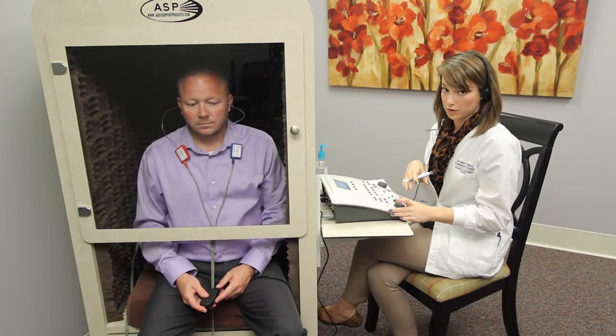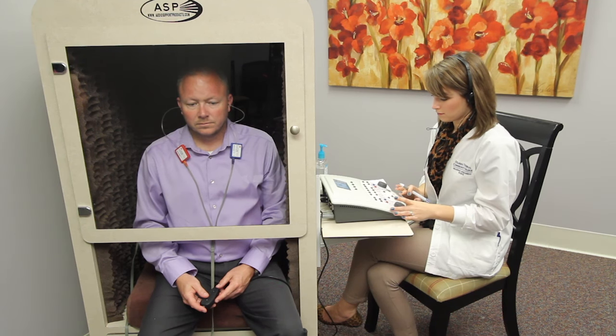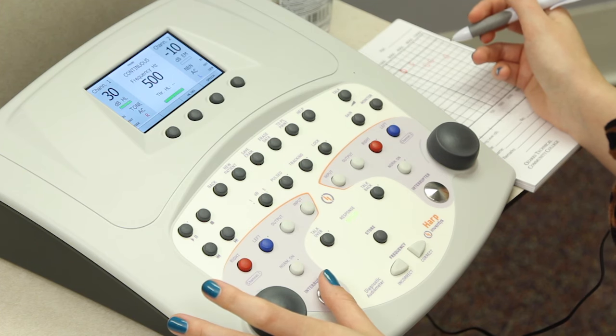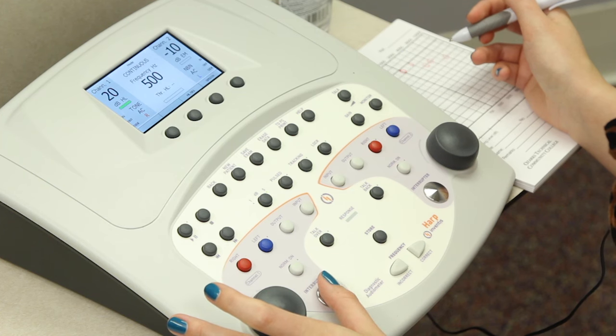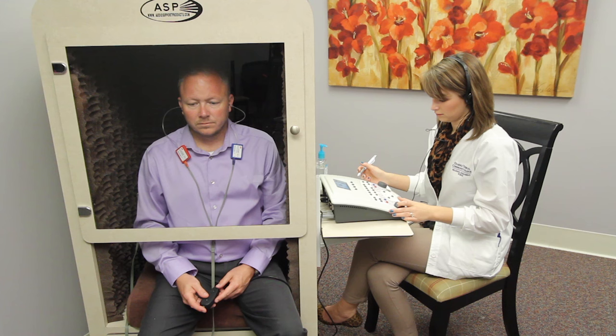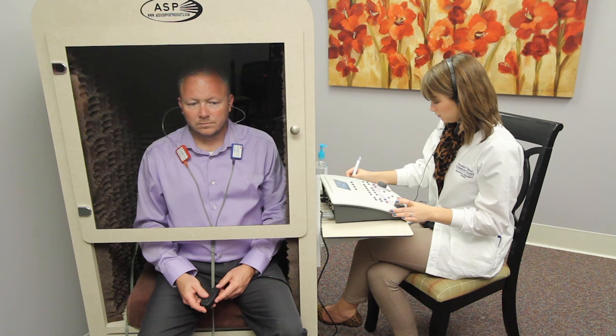We're going to move down to the lower frequencies. For this test, I'm just going to do 500 Hz because we have some lower level ambient noise in this clinic.